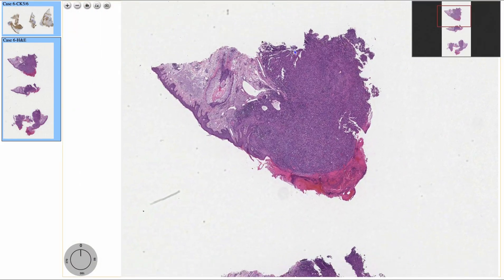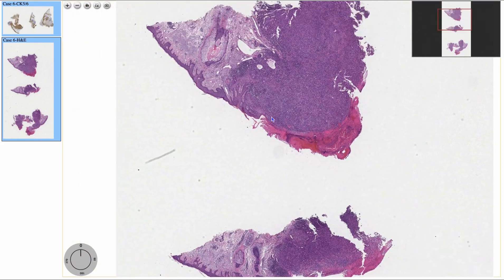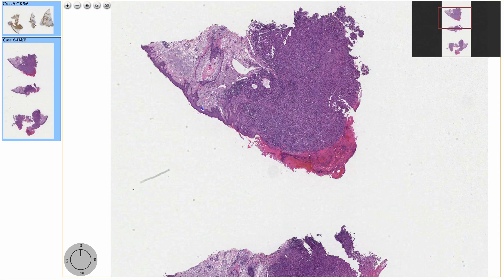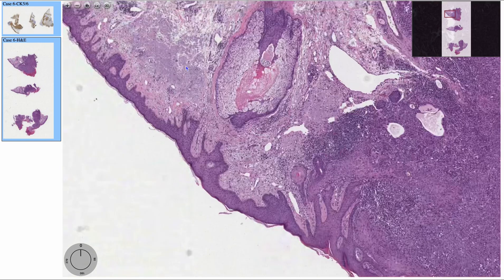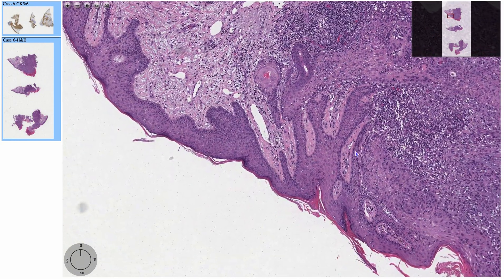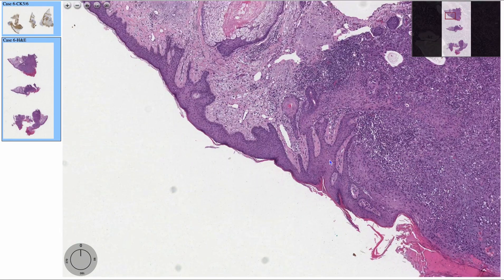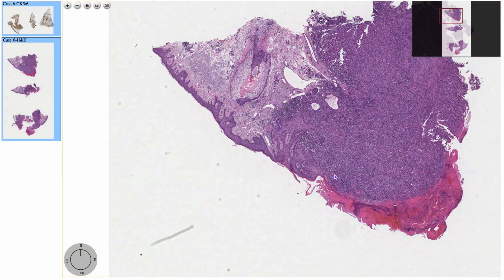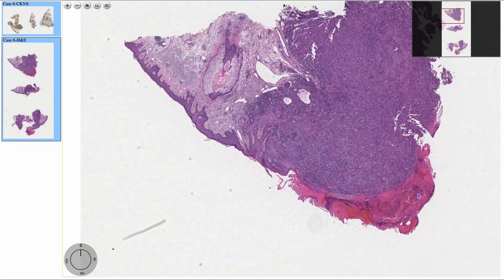In this section, we see the area of skin. We see epidermis. We see a dermis that has prominent solar elastosis.